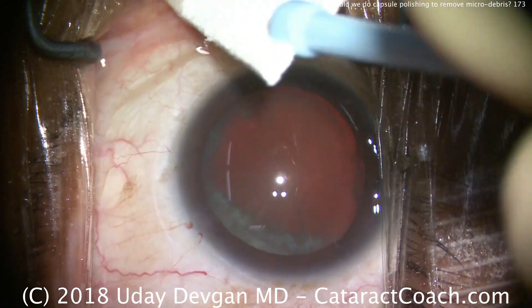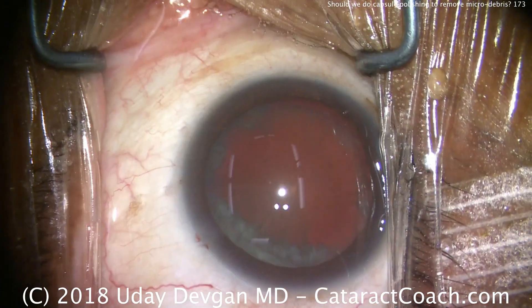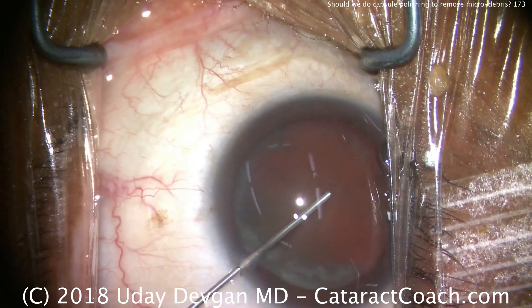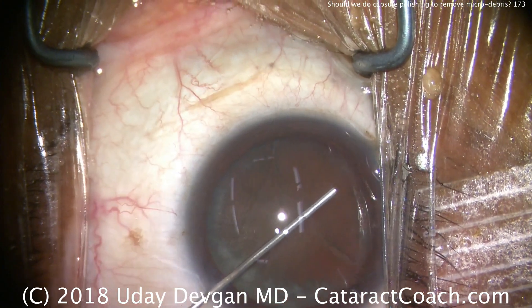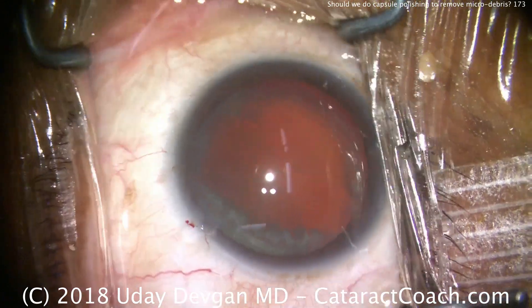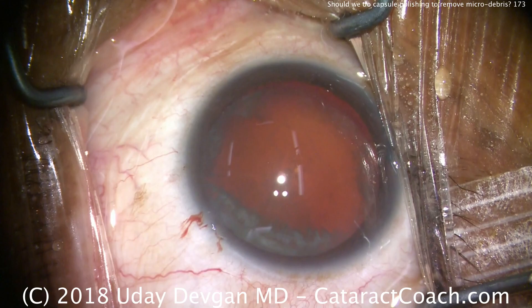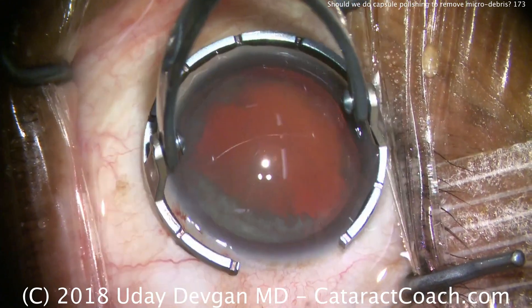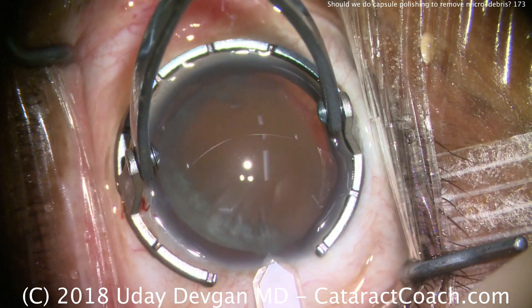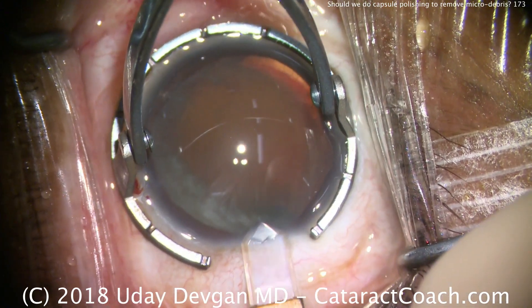It's CataractCoach.com, and today we're asking the question: do you need to polish the capsule to remove micro-debris? Specifically, does anterior or even posterior capsule polishing, when the eye is in the aphakic state, help prevent posterior capsule opacification or bad contraction of the capsule bag? Is there a use there?